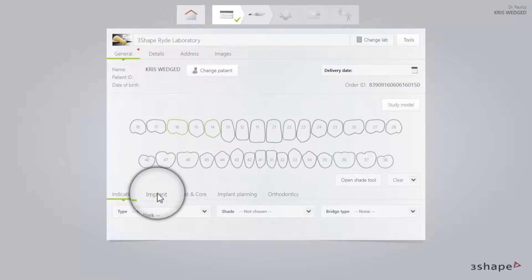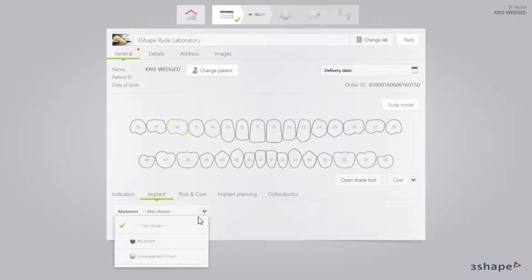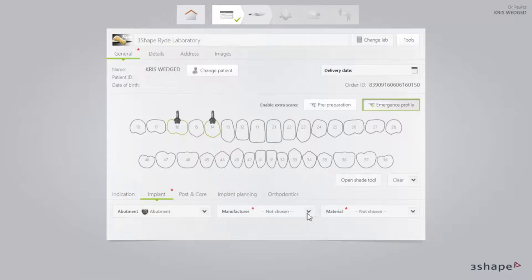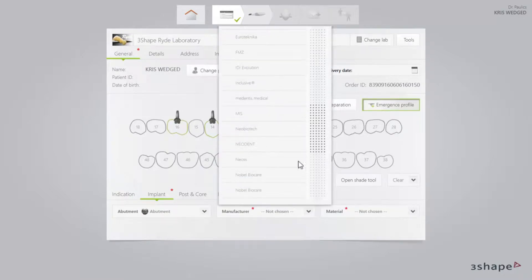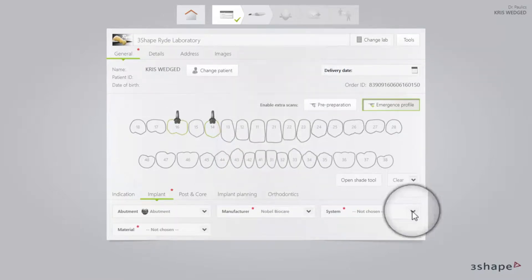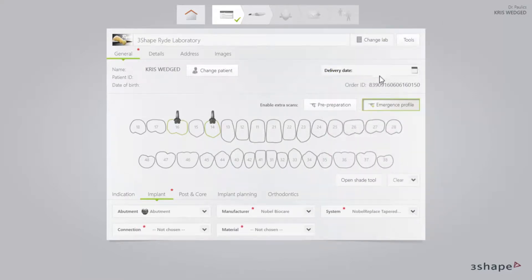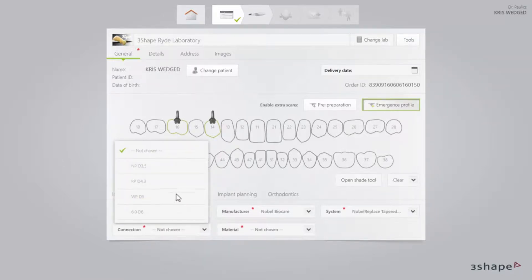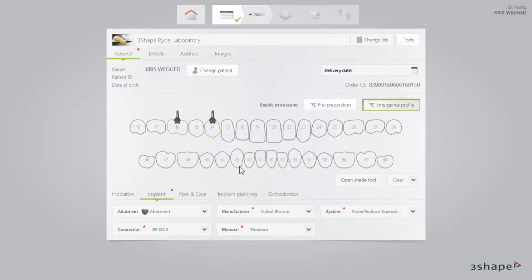Click on the Implant tab and then in the Abutment drop-down list select Abutment or Screw Retained Crown. Then use the other drop-down lists to select Manufacturer, Implant System, Connection Type and Restoration Material. You can do this for both implants at the same time or separately if you use two different implant systems.